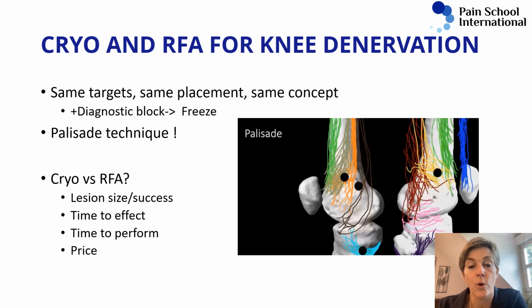So the things to consider: what is the lesion size? Because that leads to success or failure. You can use radiofrequency and make a strip lesion. Actually, for some reason, this is my preference because it's much faster. I can use a big 16 gauge needle, place it along the femur at multiple locations, and I can actually place multiple probes at the same time, so it's fairly efficient. Done. The trouble is that you have to tell the patient, okay, it's going to take 2 to 3 weeks until you know how we did.